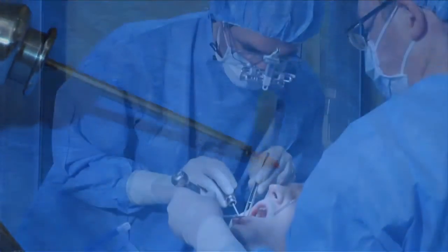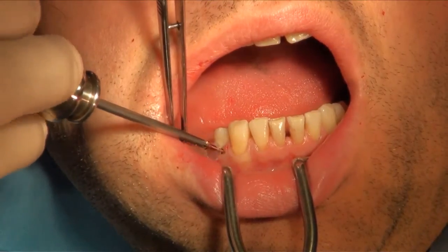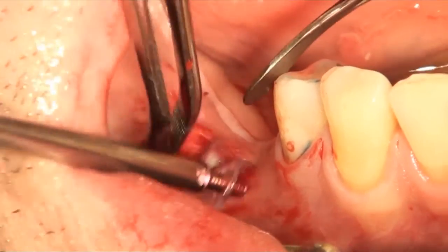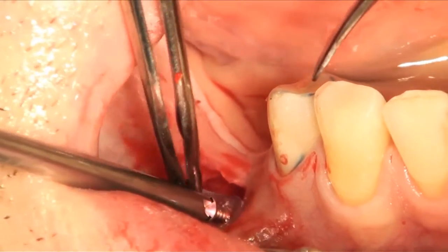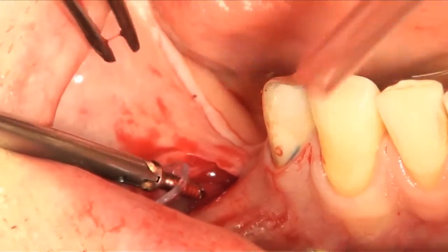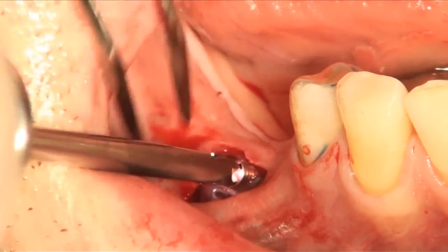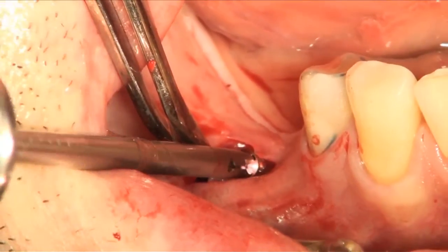And then the expander is transferred to the pouch. Now the expander is placed into the pouch and we fix the bone fixation screw.